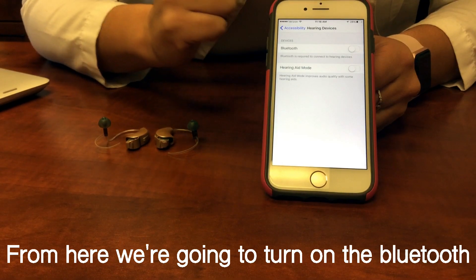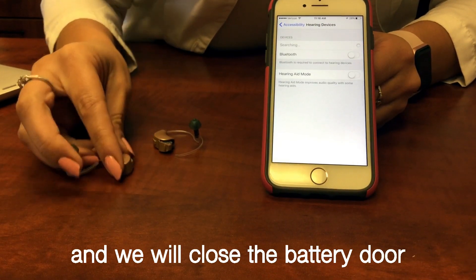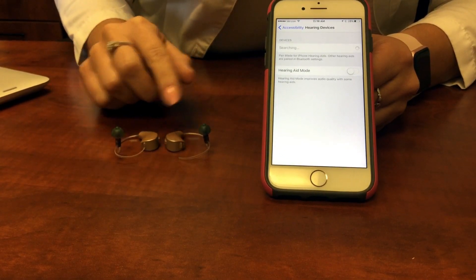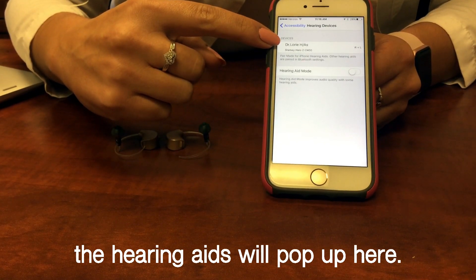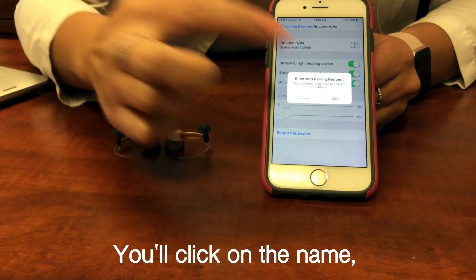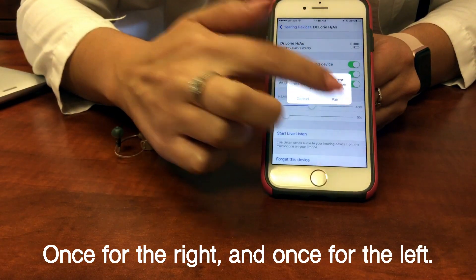From here we're going to turn on the Bluetooth and we will close the battery door of the hearing aids. Once those have restarted, the hearing aids will pop up here. We'll click on the name and we're going to pair twice — once for the right and once for the left.